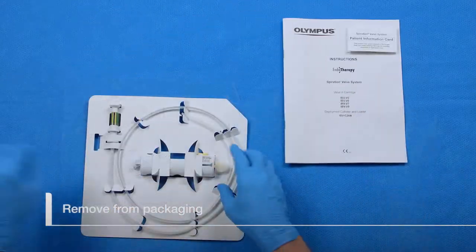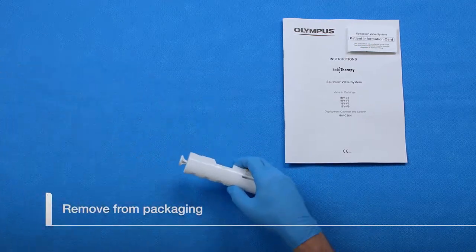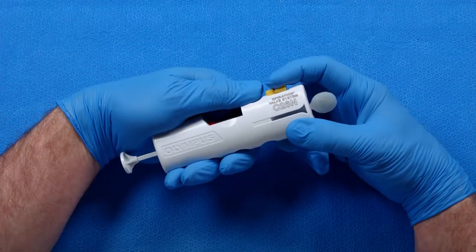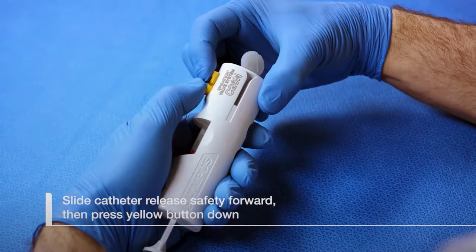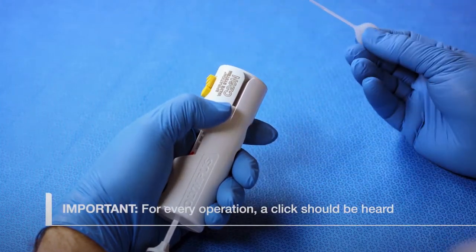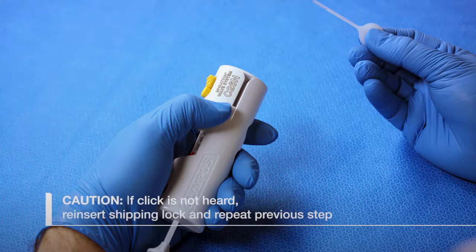Save the instructions for use and patient information card. To remove the shipping lock from the loader, push and hold the catheter release safety slider forward, then press the catheter release button down until an audible click is heard, releasing the shipping lock. If a click is not heard, fully reinsert the shipping lock into the loader and repeat the previous step.